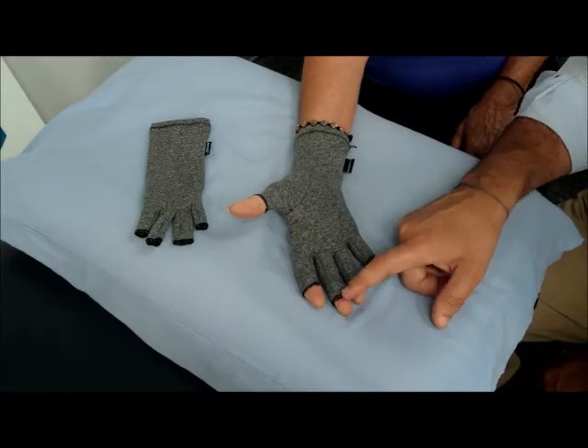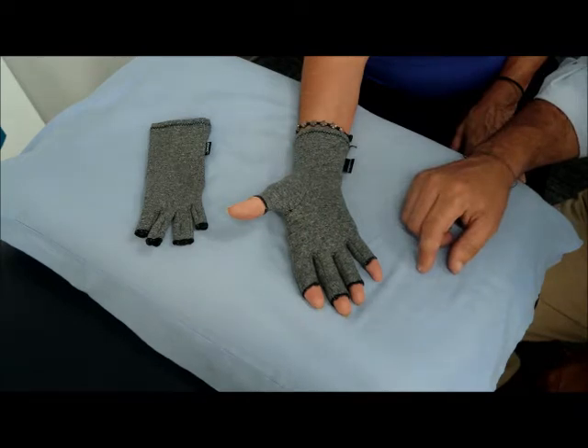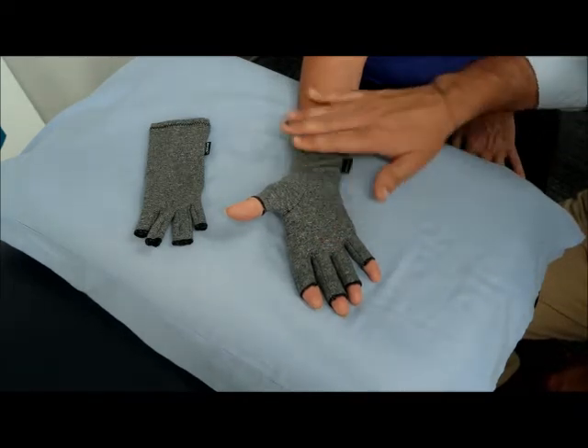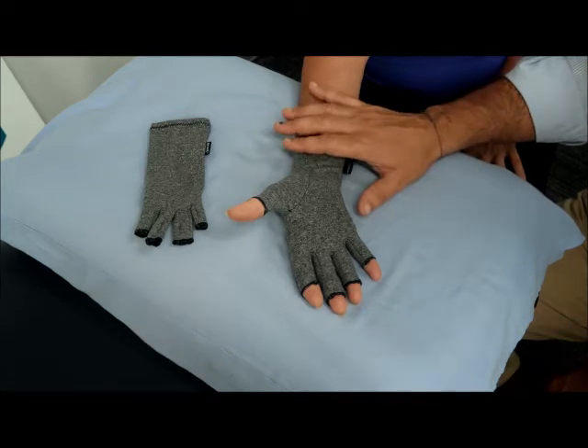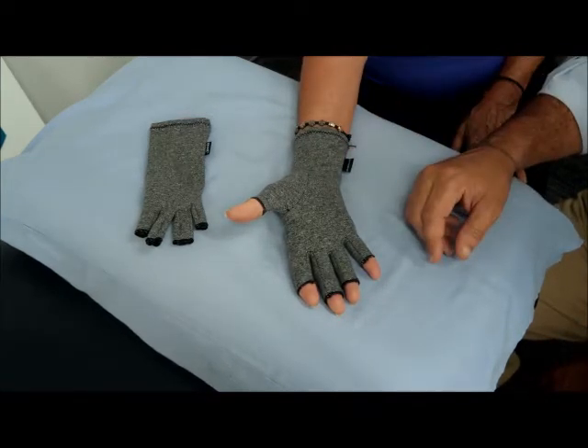You can see there's a nice ribbing around the ends to stop fraying, and that seems to have lasted quite well for clients. The dark colour means that stains are a bit hidden, but you can wash these with just warm soapy water or you can even throw them in the washing machine.